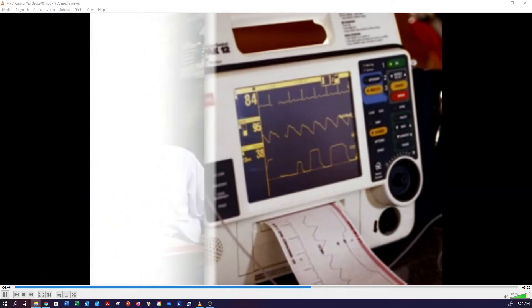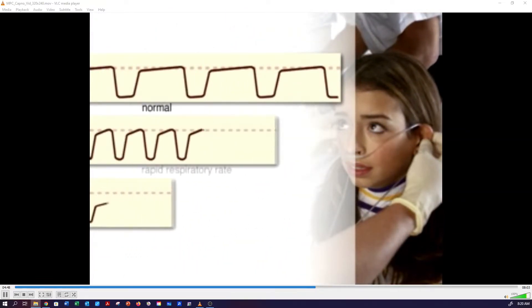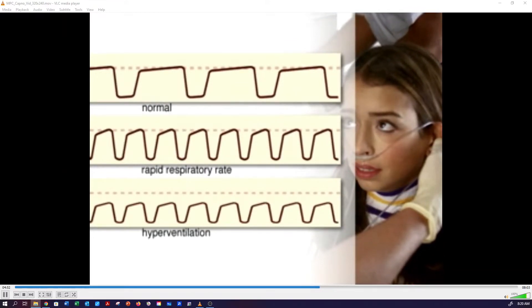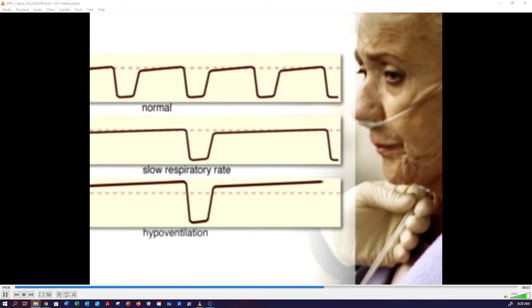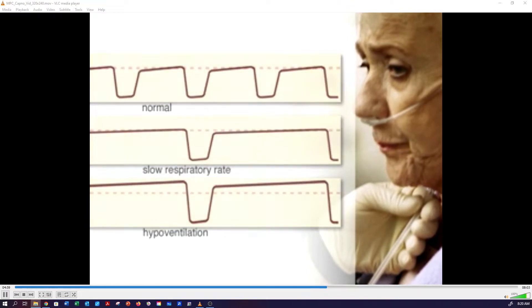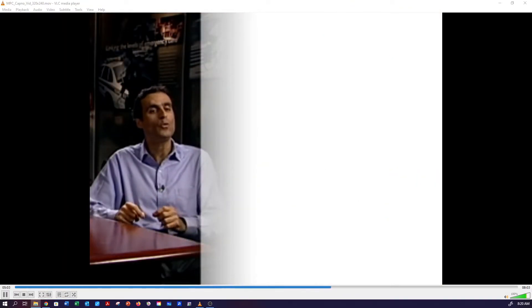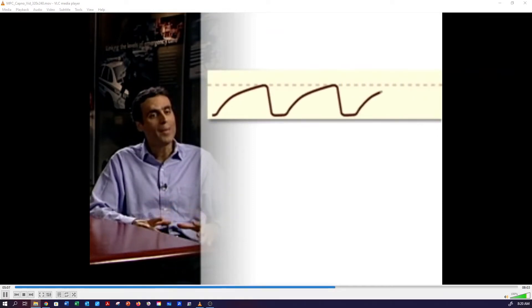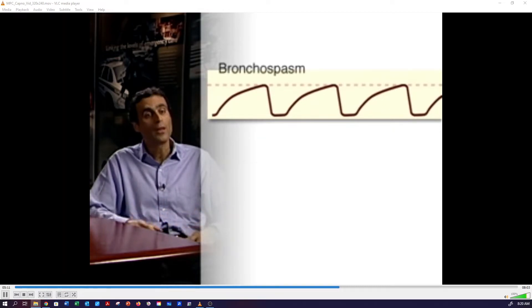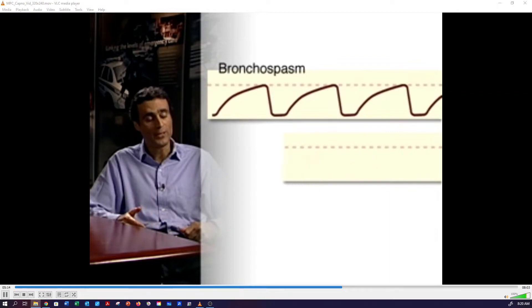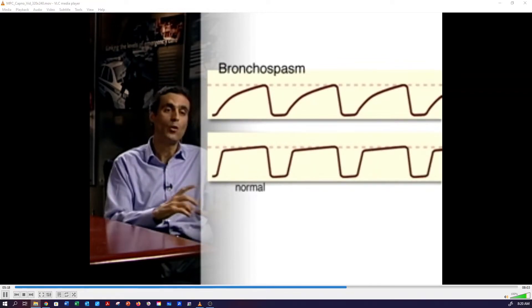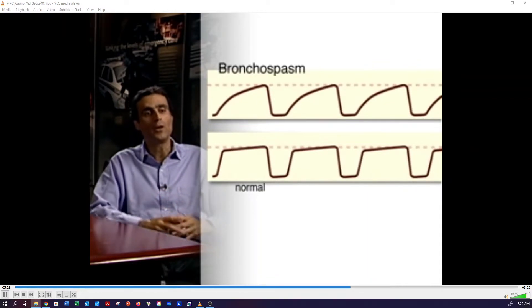Compared to ECG, it's simple to spot significant changes. Here are some of the more common variations from normal. Capnography can help you immediately recognize changes in the respiratory pattern. Just like you use an ECG to tell the difference between tachycardia, bradycardia, and a normal rhythm, you can use the CO2 waveform to tell the difference between a rapid respiratory rate or hyperventilation, and a slow respiratory rate or hypoventilation. You can also use the shape of the CO2 waveform to tell you about specific disease states. The most common abnormality in shape occurs with bronchospasm in asthma and COPD patients — a change from the normal box-like rectangular appearance to a curved or shark-finned appearance.